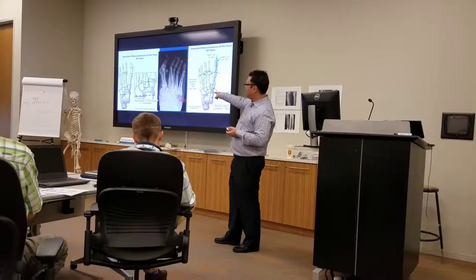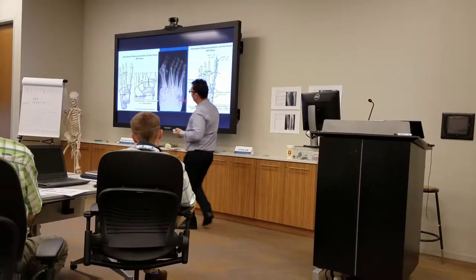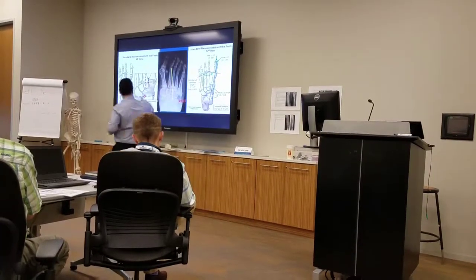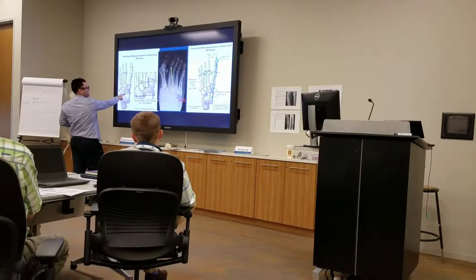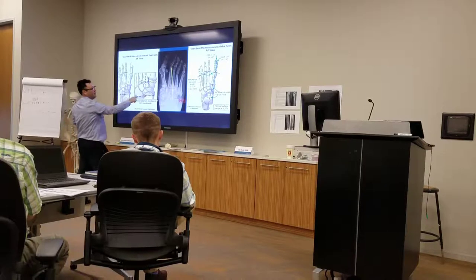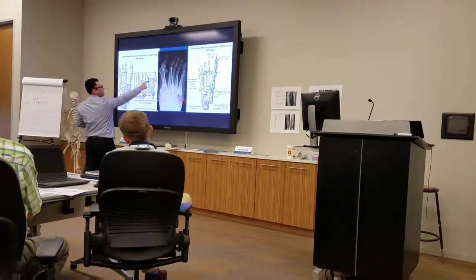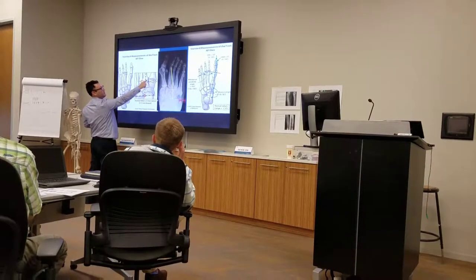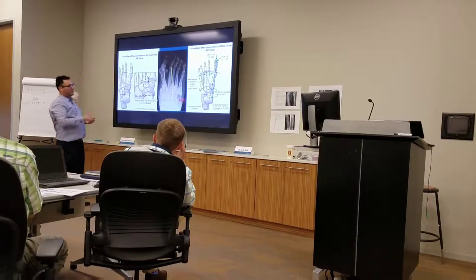So here's another one. It's a little bit different than the one we had before. This is more of a translational deformity. You see that whole foot got translated immediately over. If you look at your mechanical axis going from the second metatarsal head to about the lateral aspect of the talar head, it's supposed to be 5 millimeters lateral from the base of the first metatarsal on the lateral aspect. But over here, instead of 5 millimeters, it's 26 millimeters. So there's a lot of translation in that.